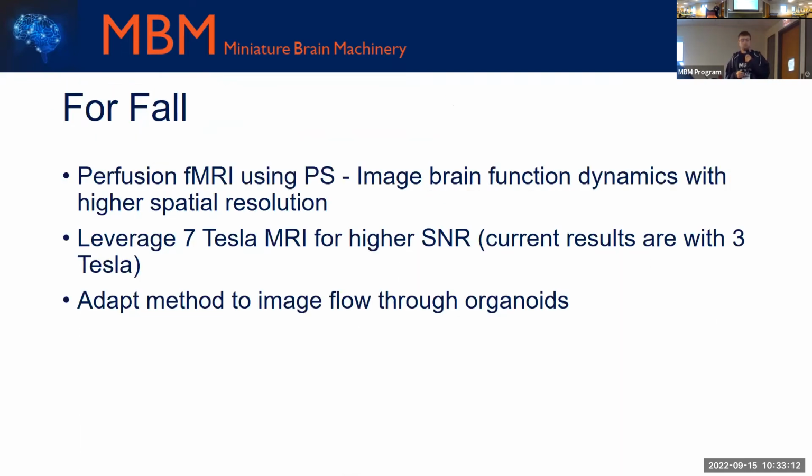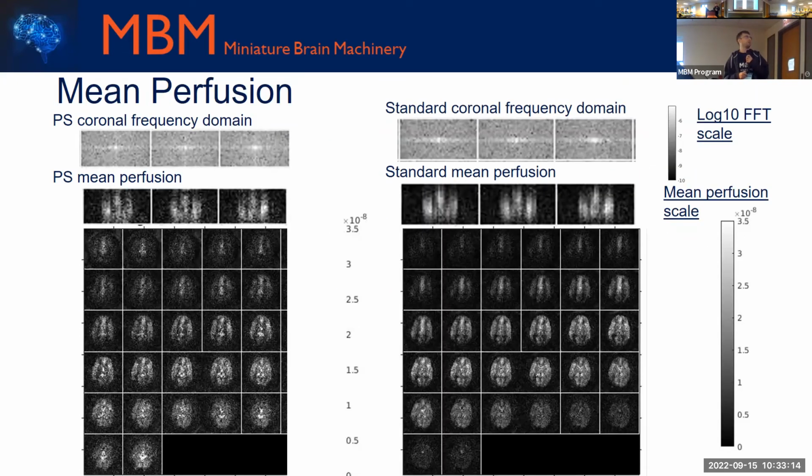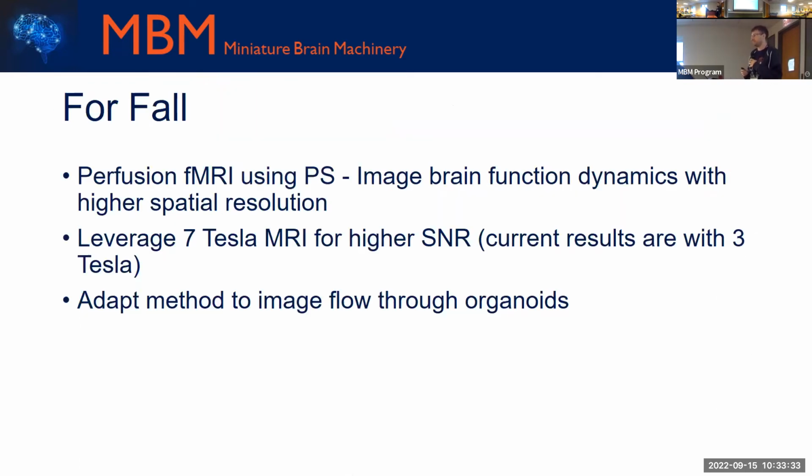within these k-spaces, and the standard recon is more of a horizontal axis. And that vertical axis tells us that we're collecting higher signal within the PS recon compared to the standard. And that we have those higher frequencies that correspond to a higher sharpness in the Z direction.